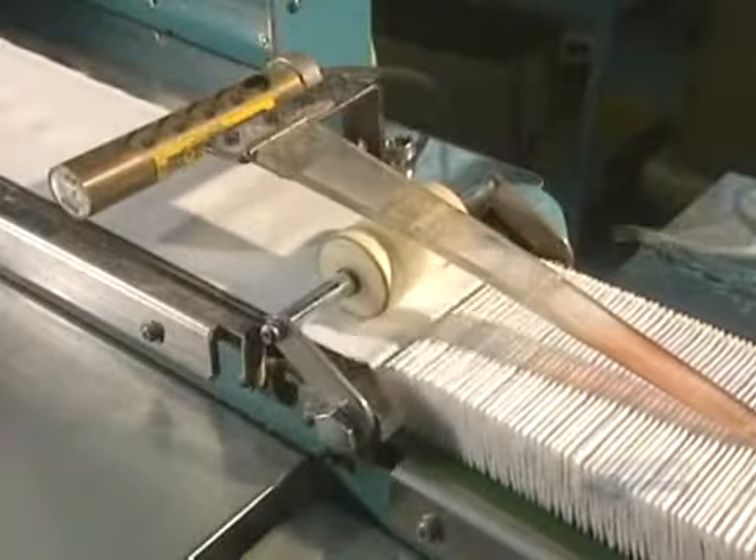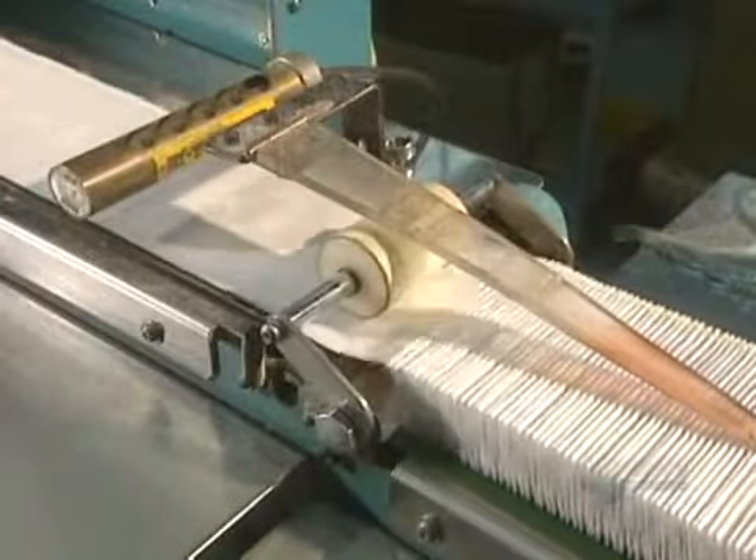Certain types of bandages have to go through a sequential bandage machine to have aeration holes pierced in them. These holes allow air to circulate and thus help promote healing. These bandages are now ready.